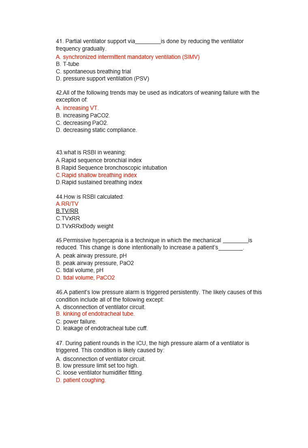Next is, what is RSBI in weaning? It is the rapid shallow breathing index. How to calculate RSBI? Already discussed, it is the ratio of respiratory rate or frequency and tidal volume in liters, and it is expressed as breaths per minute per liter.